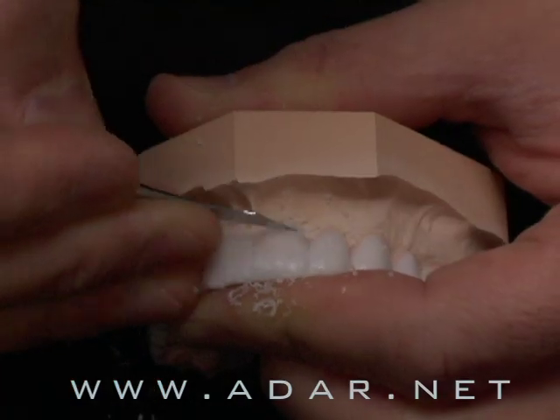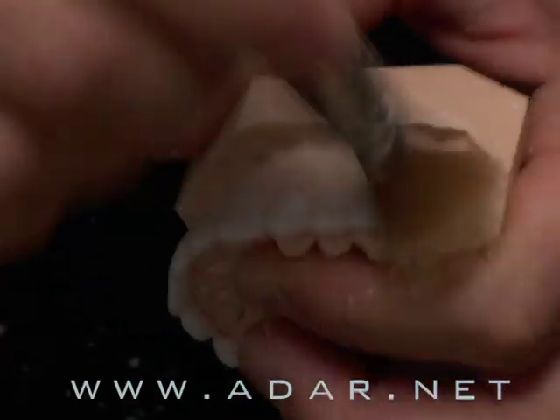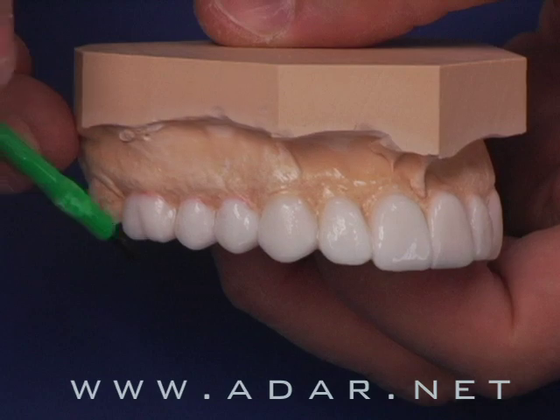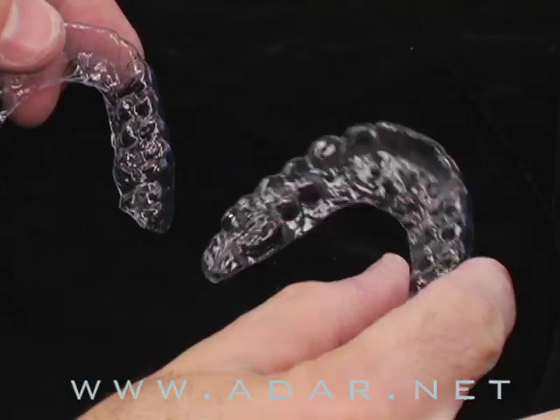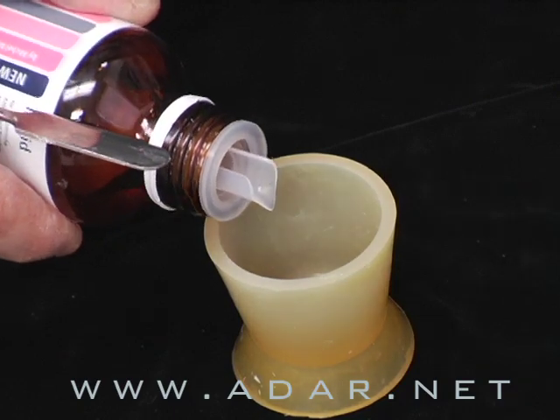I'll show you how to take an impression, fabricate the master model, and go step by step through the wax-up process, as well as finishing up the wax-up so patients will be motivated. We'll duplicate the wax-up and use a vacuum-form matrix to process this device.